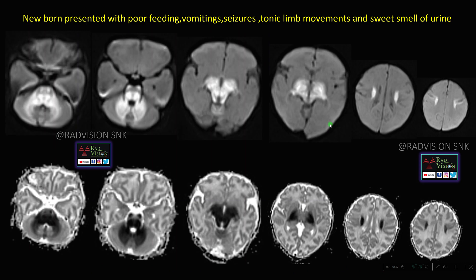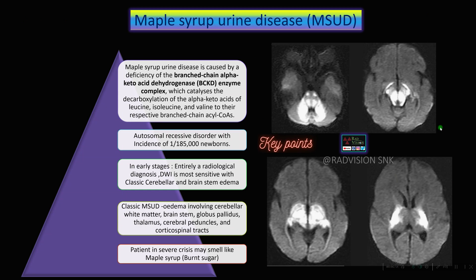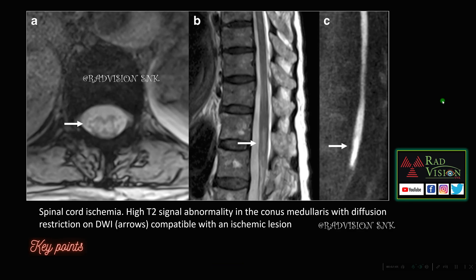Next: this is a newborn presenting with vomiting, seizures, and sweet smell of the urine. You can see classical restricted diffusion on DWI in the brainstem and cerebellum, extending along the corticospinal tracts with low ADC values. This was a case of maple syrup urine disease. Whenever you see classical restricted diffusion on DWI in the brainstem and cerebellum in a child with sweet smell of the urine, definitely suspect maple syrup urine disease.